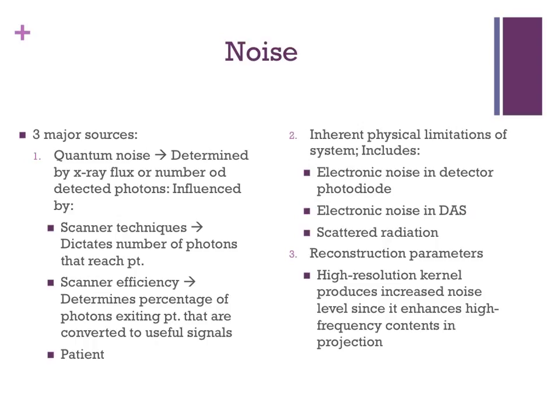The third major source contribution to noise are reconstruction parameters. A high-resolution kernel produces an increased noise level since it enhances the high-frequency contents in the projection. However, most noise represents itself as high-frequency signals and is enhanced at the same time.